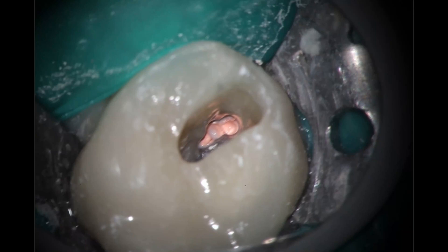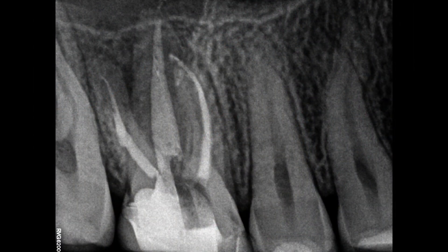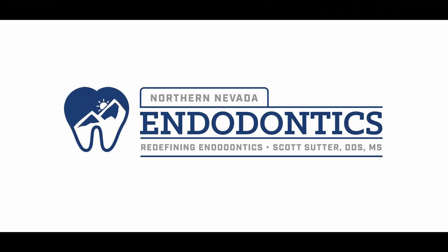Looking at the final, you can see where that MB2 was — just kind of a fin that came off — but that is enough sometimes to cause failure, so it's still important to find MB2s. The incidence is far higher than you think; I would say it's in the nineties. I'm very pleased with how this all turned out. He's going back to his general dentist to get it sealed back up. As always, if you have any questions I do read every comment — leave those below, thank you so much for watching, and please let me know if there's anything else you'd like to see.